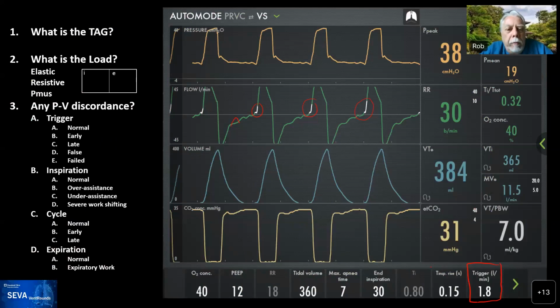In hindsight, this is the classic case. We see this very often. The patient is paralyzed or brain dead, and there continues to be triggering of the ventilator, and the team starts troubleshooting this and goes through a series of items. First, is the infusion going into the patient or not? This has happened because now we use more peripheral lines.